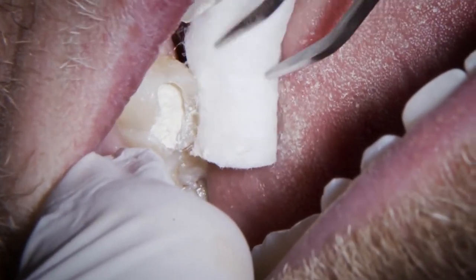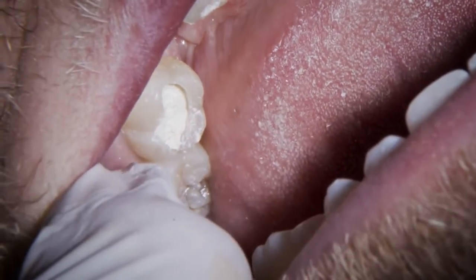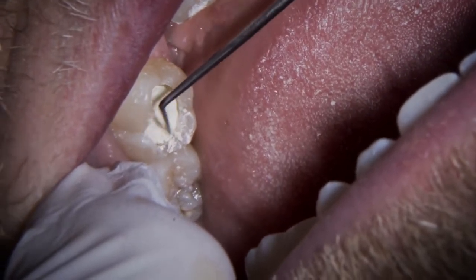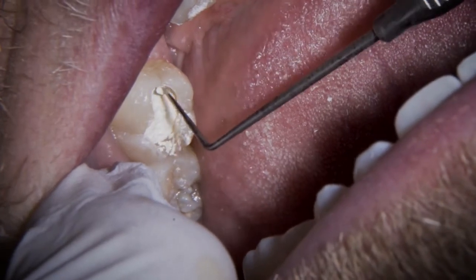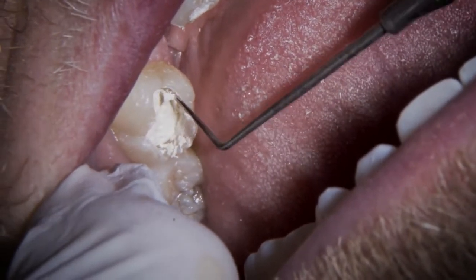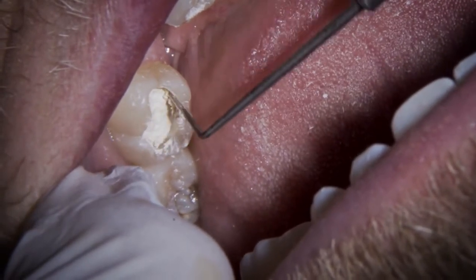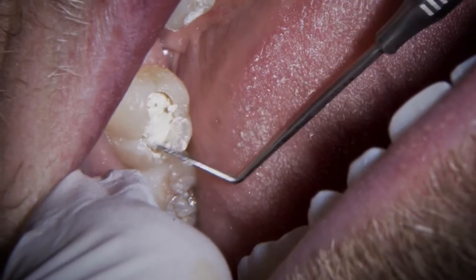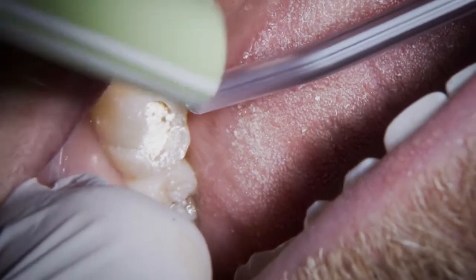Let's take this out a moment. The cotton wool rolls have stayed really nice and dry. As long as I've got that initial set and it started to retain its shape, then I'm happy. We'll put the cotton wool rolls back in — having some saliva washing over that setting surface doesn't affect it too much.